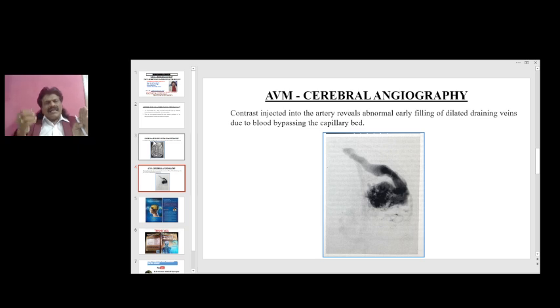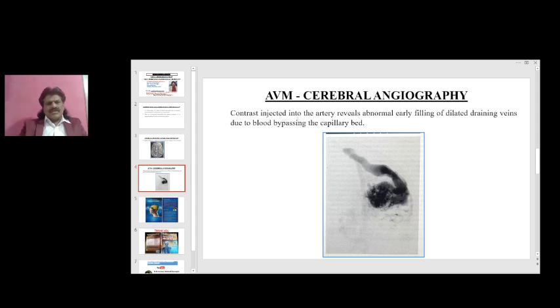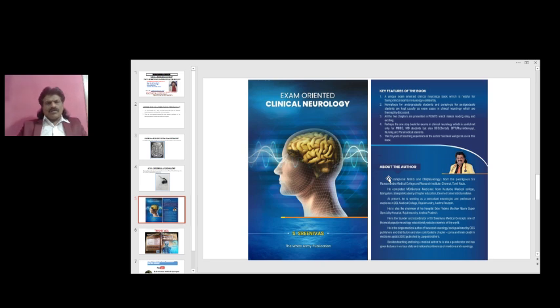The early filling or early dilatation of the draining veins is a diagnostic feature in neuroimaging to diagnose arteriovenous malformation. Here you can see in this imaging that contrast injected into the artery reveals abnormal early filling of dilated draining veins due to blood bypassing the capillary beds. This early dilatation of the veins is the diagnostic feature of arteriovenous malformation.